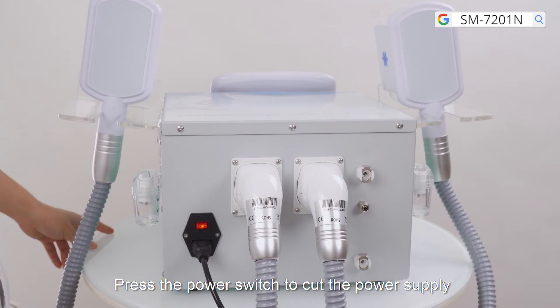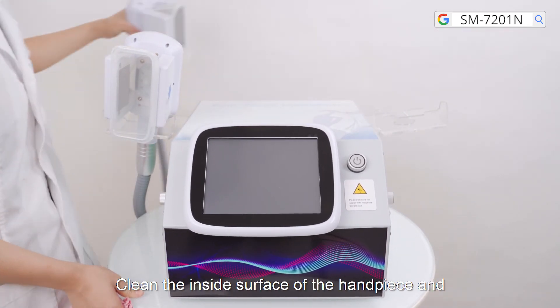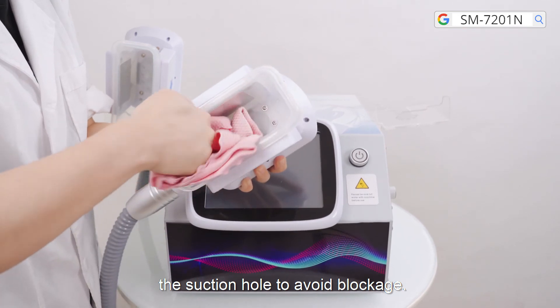Press the power switch to cut the power supply. Clean the inside surface of the handpiece and the suction hole to avoid blockage.